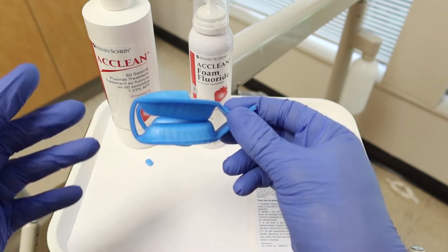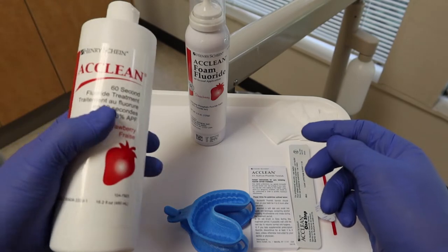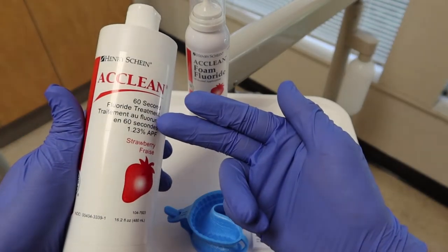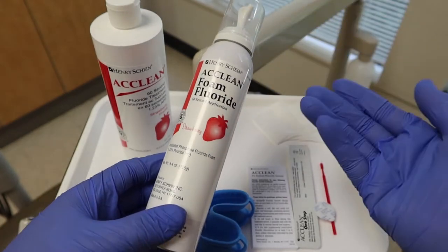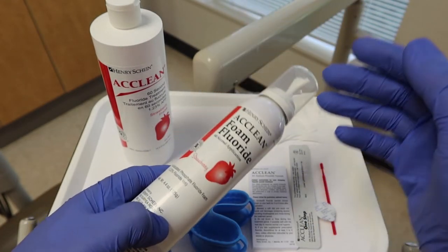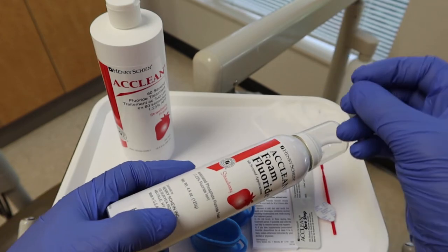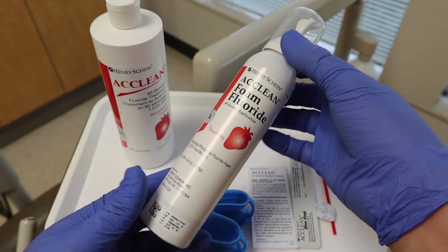Right now we have two different types of bottles — fluoride gel and fluoride foam. Same thing, same nasty taste and everything. Strawberry, which kind of tastes like strawberry yogurt that's been expired for a good long time. So it's whatever floats your boat for the most part.